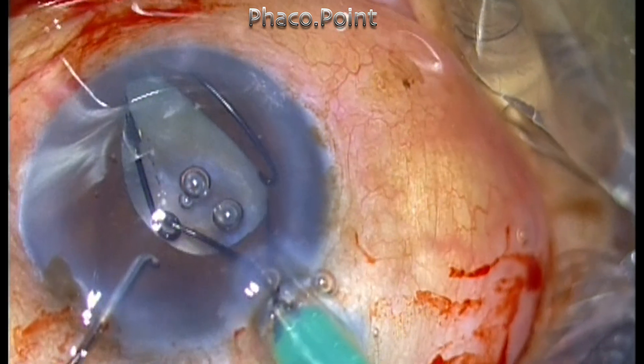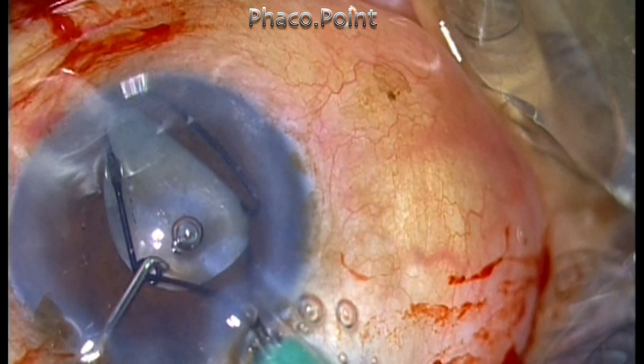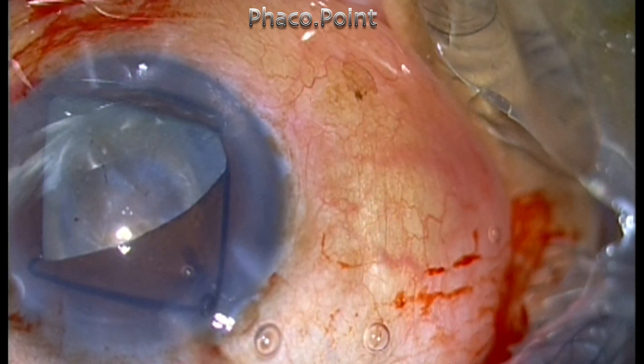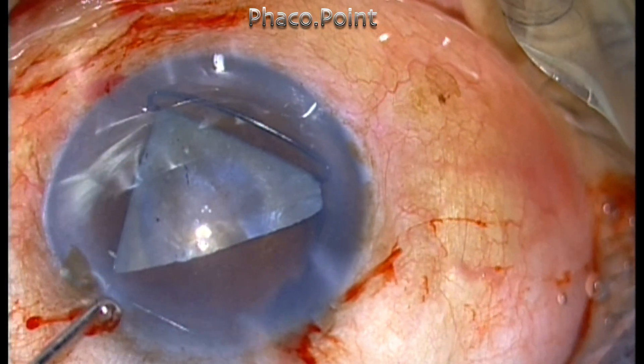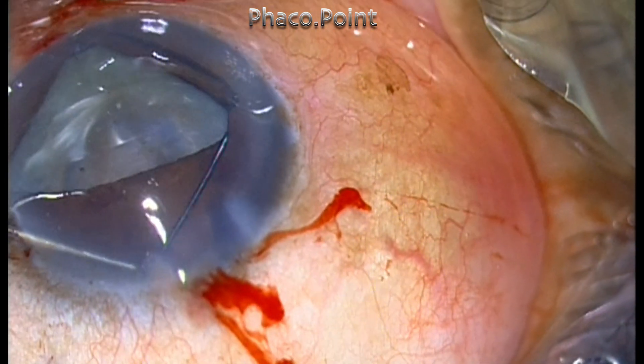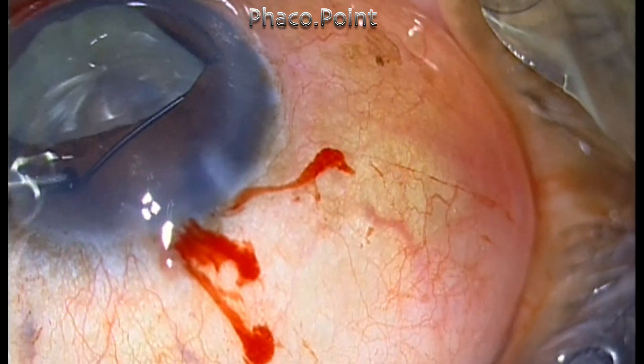As the ring went in, I thought I saw the lens shake, which gave me apprehension about whether there was a zonular dialysis and whether the patient had a subluxated lens as well. However, the patient did not have any phacodonesis in the pre-operative clinical examination.